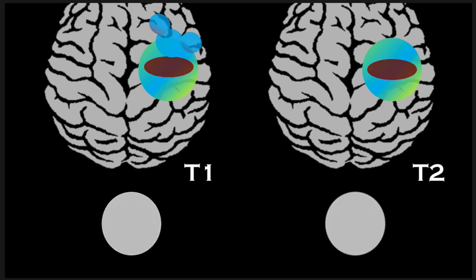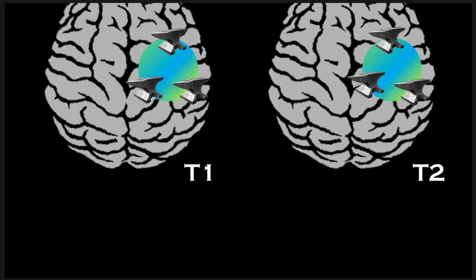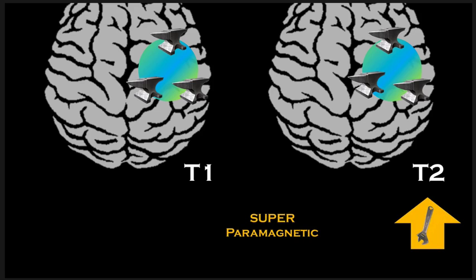And then lastly, right, it's going to break down and be changed into ferritin and hemosiderin, and that's going to create that really strong paramagnetic effect, super paramagnetic effect, which is going to revive our T2 star effect and drop our signal back out. And also, because the hemoglobin broke down, we lost our methemoglobin, which was the thing that was making the water protons be bright instead of their usual darker or iso configuration. So now we're in a dark situation.